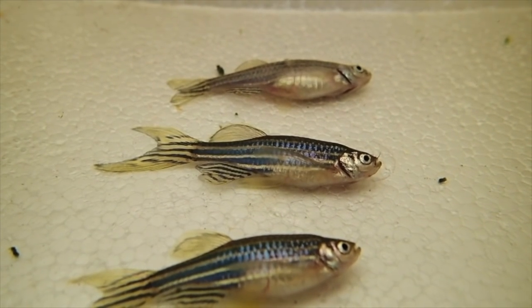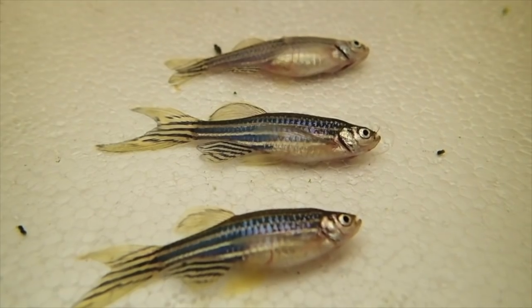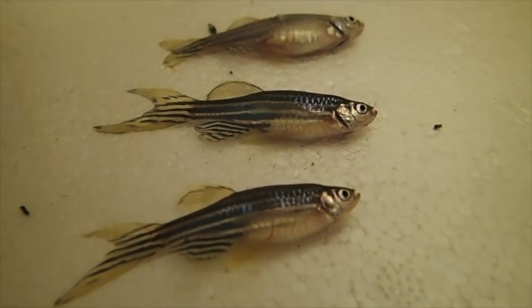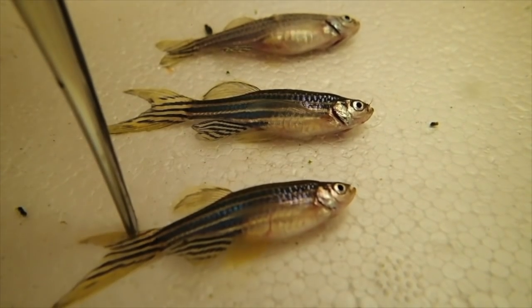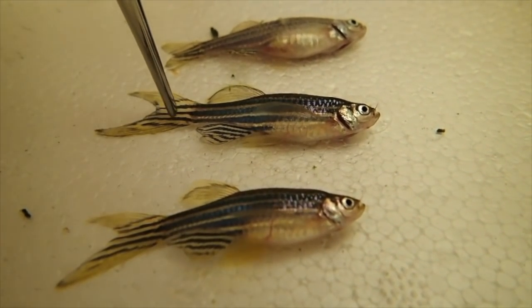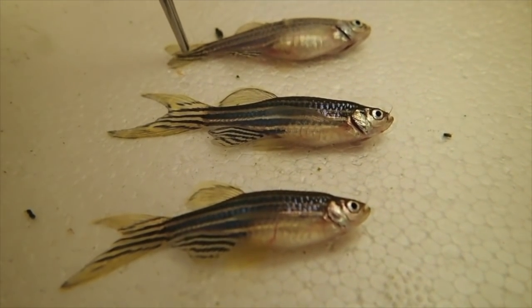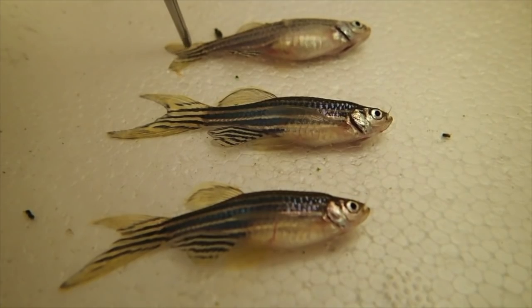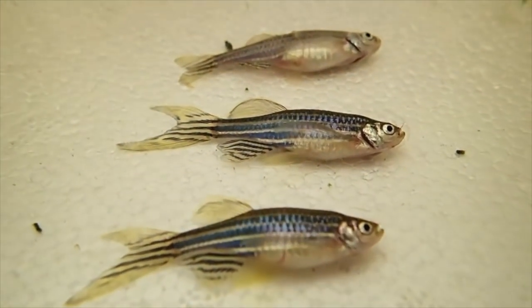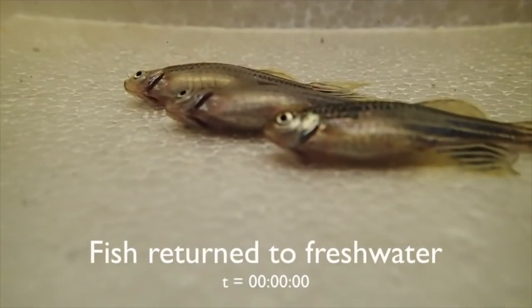Here we have stage 5 anesthesia, where the respiratory rate is slow and irregular. For surgery you want to keep the fish between stage 4 and stage 5, and not too far into stage 5, otherwise you run into the danger of respiratory and then cardiac arrest. From time to time you can check whether the spinal reflexes are still there and keep an eye on the opercular movement.